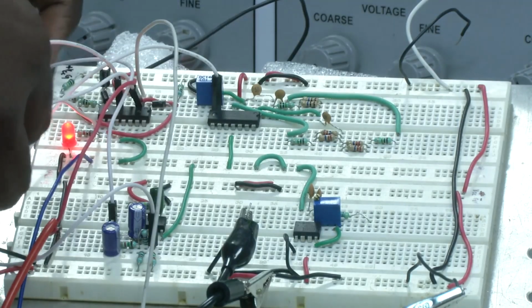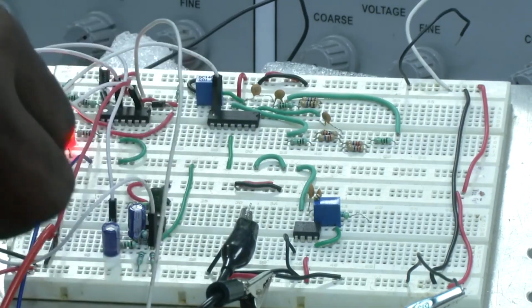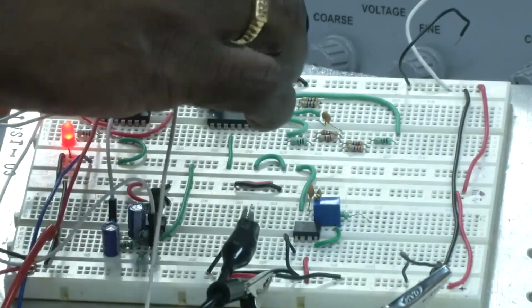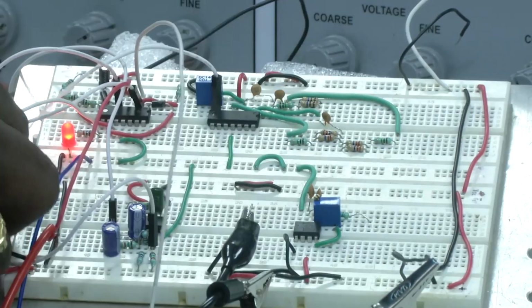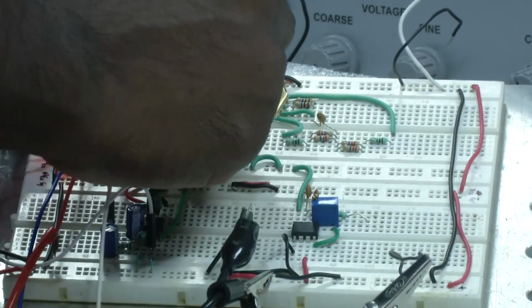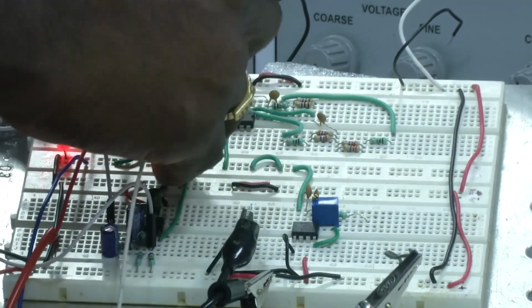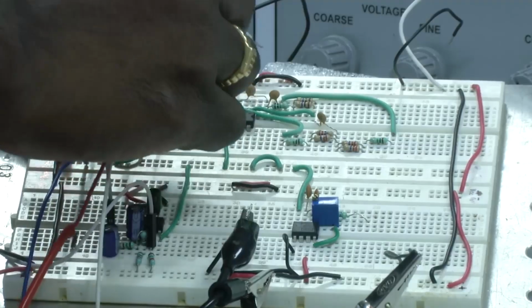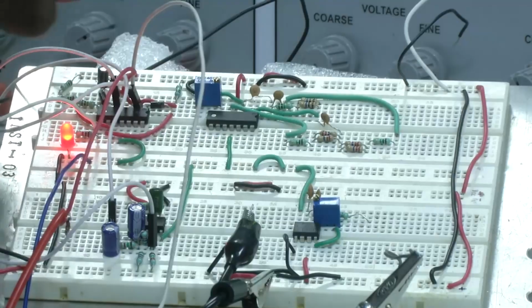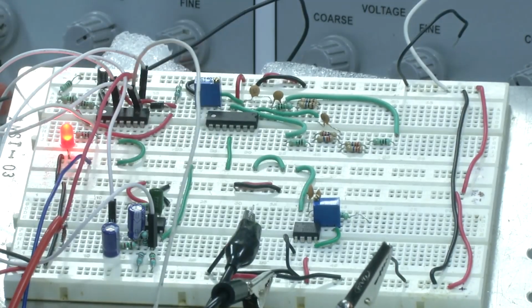Now, in this case, I will take the second CRO probe and connect it to the second pin. So the third pin is the input. I am connecting it to the third pin of the input signal, and the second pin is the output. I am connecting it there, right.